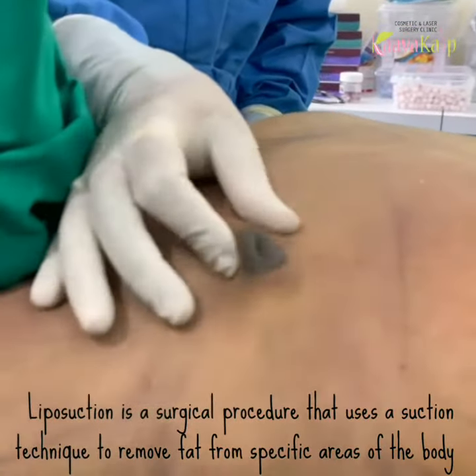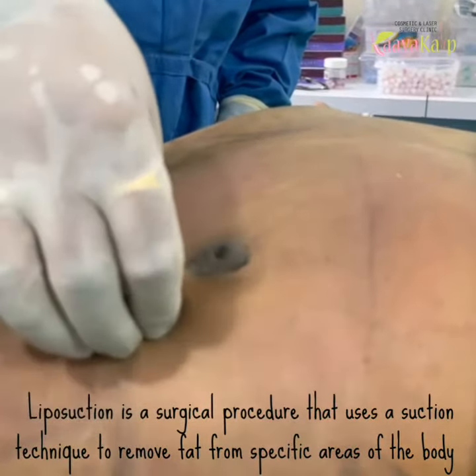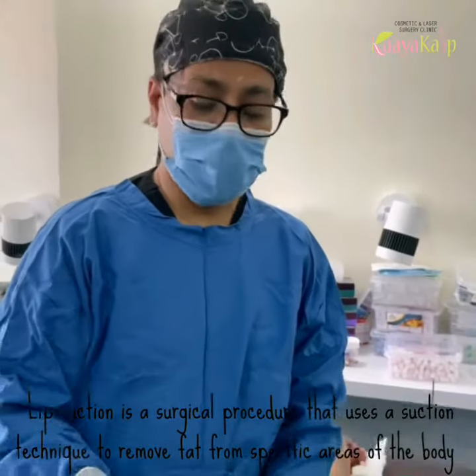There is a bit of skin laxity, so for that I will be using a body-tite — that is an RFAL. I will be doing that, which will help in shrinkage of the tissue and skin, and give a good chest contouring.